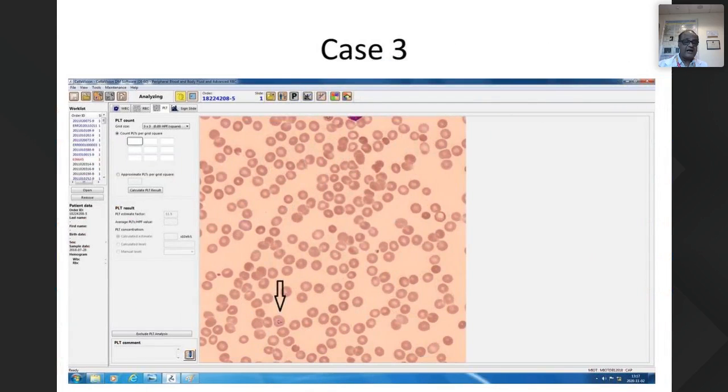Let us see the higher magnified power in the platelet ones. Again, you get the ring forms here. We are able to pick up the parasites in not more than 3 to 4 minutes. You can pick up the malarial parasites, confirm the species, and tell your clinicians as a critical alert itself.